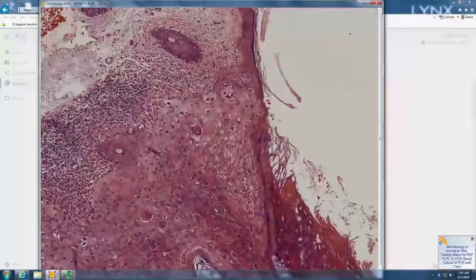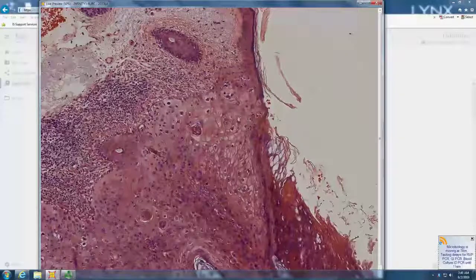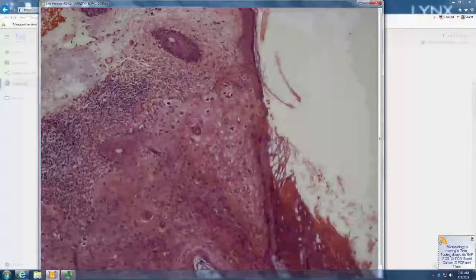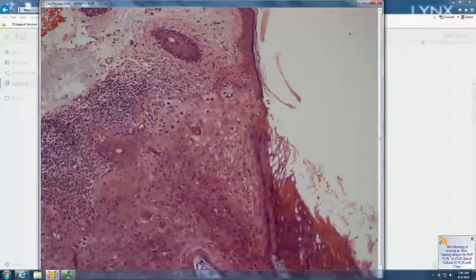I was trying to see if I see atypia in there. There's definite atypia there. So this is squamous, yeah, or since it's all in situ, full thickness Bowen's, and probably, since you said it looks like a wart, papilloma virus induced Bowen's.